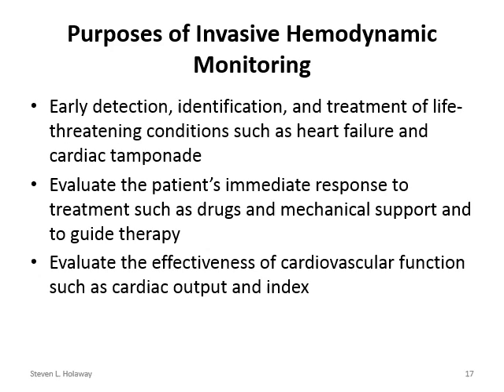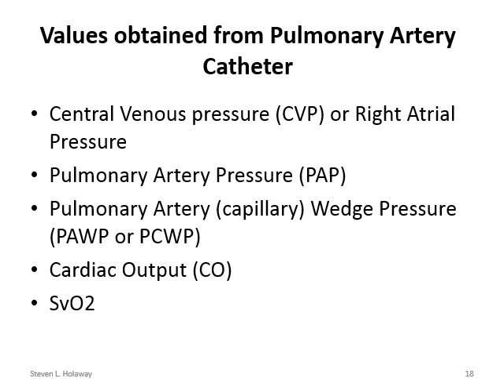For years this was the only real way to get a good cardiac output without going to the cath lab. There are new systems using the arterial line where we can get a good calculated cardiac output based on flow rates through that arterial line. So many times these patients will not need a Swan. We can just do an art line to get good cardiac output if all we're looking for is cardiac output and cardiac index.